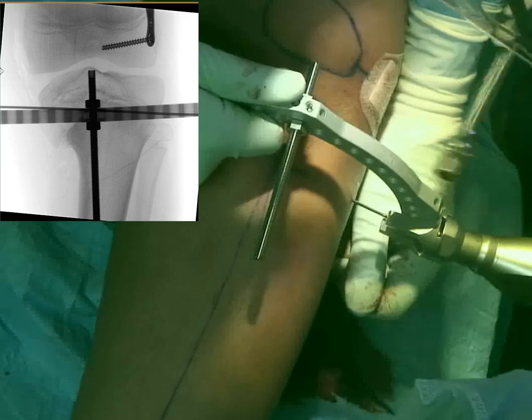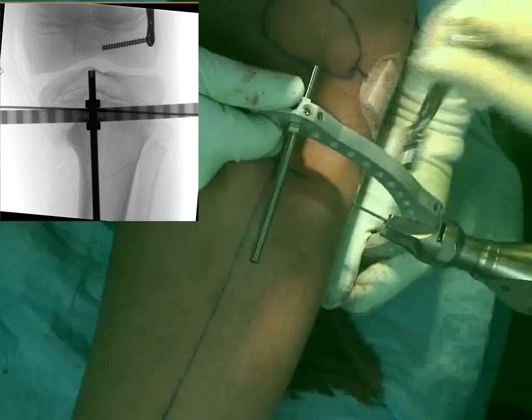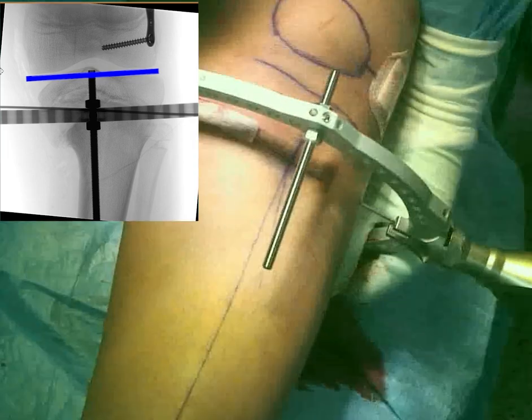On the AP, I want to make sure that my ring is parallel to the joint surface. And here, because there's a proximal deformity of the tibia, I rely on the distal surface of the femur. As you can see here, my ring is parallel to the distal joint surface of the femur.